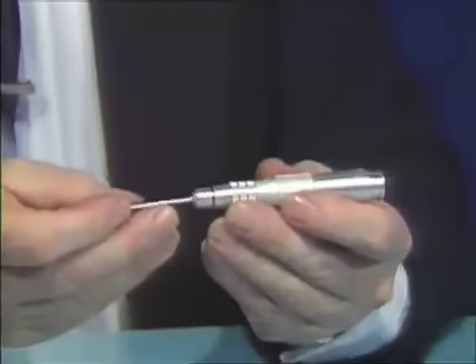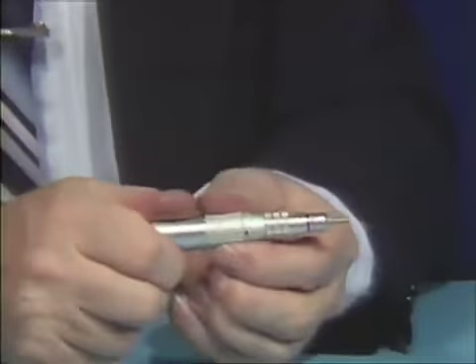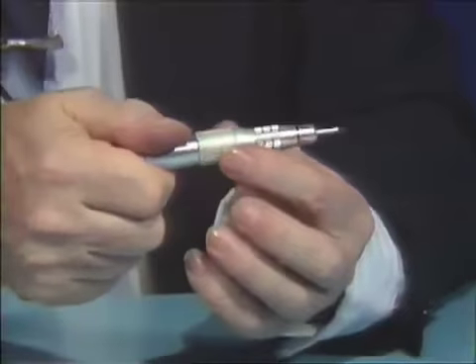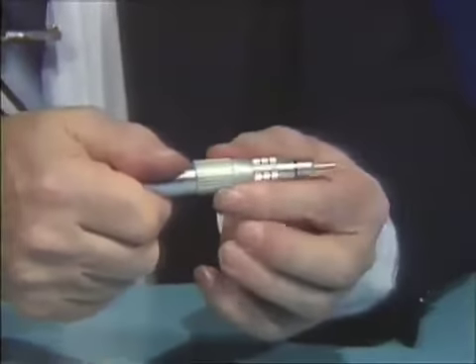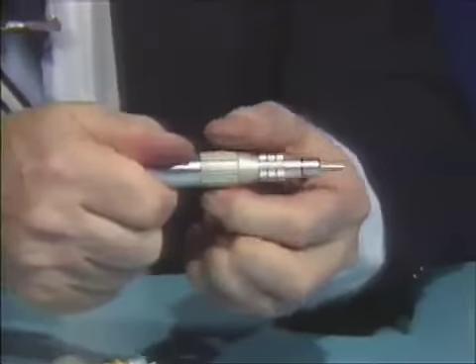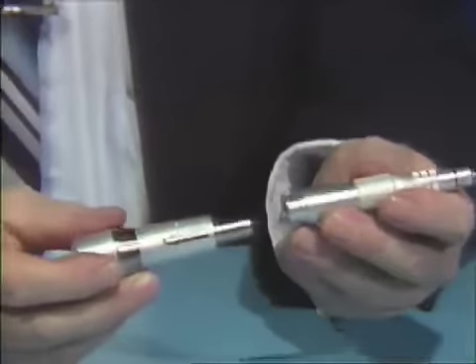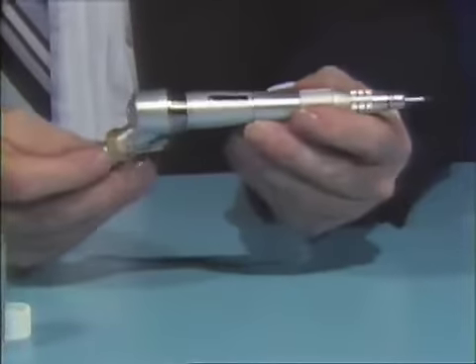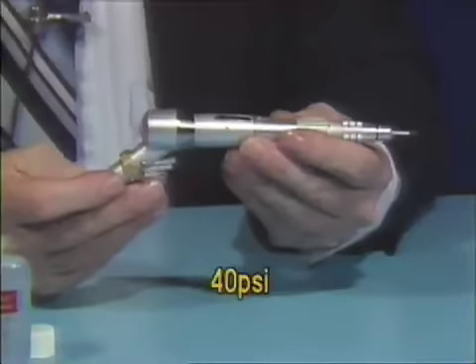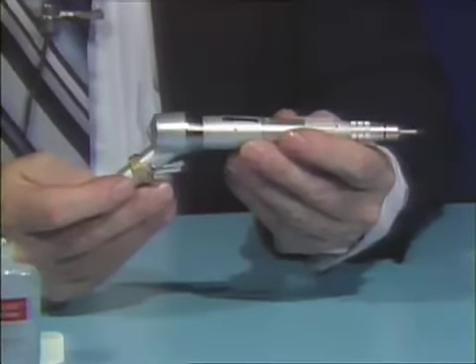After cleaning, insert your shipping pin, mandrill, or burr, and tighten up on the latch, turning it all the way. Whether you tighten or loosen the latch, you must go all the way — not halfway. Then attach the straight attachment onto the shorty motor and run it. The pressure to run it at is 40 PSI, just to get the excess lubrication out of the handpiece and straight attachment.